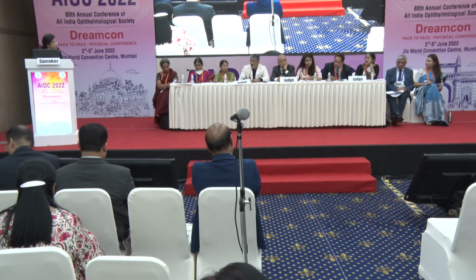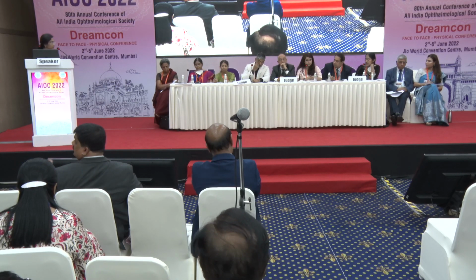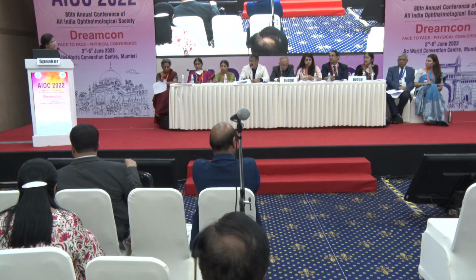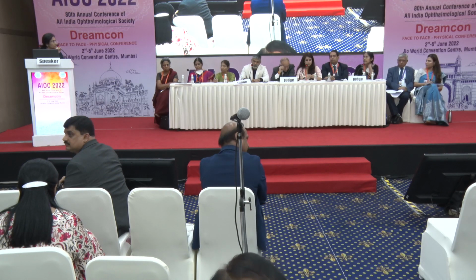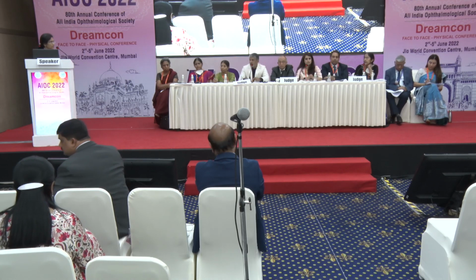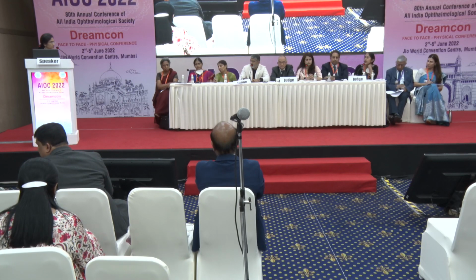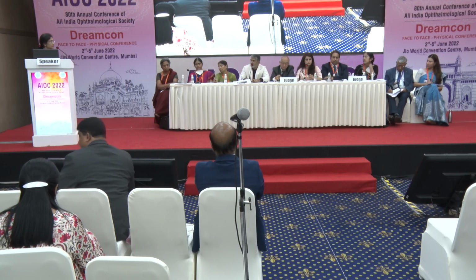These days we detect very early keratoconus based on changes in the posterior cornea. So even for a screening tool, just because you're seeing an asymmetric bow tie, that is not a detection of keratoconus. And if you want a screening tool, retinoscopy works even today very well. You will be able to see doubling of the mires in retinoscopy even in today's context. And if you are not going to address the thickness of the cornea or the posterior cornea, a screening tool may not be really that valuable.